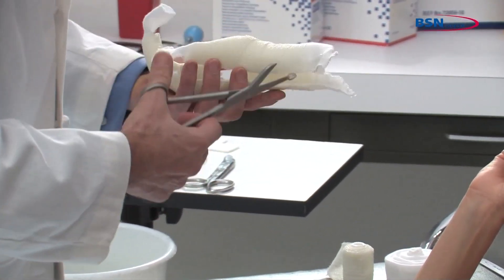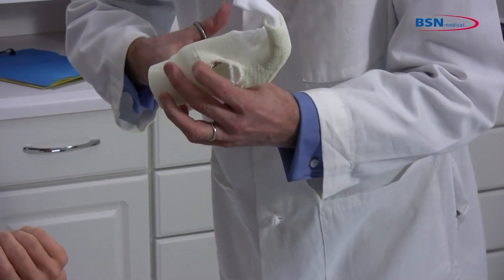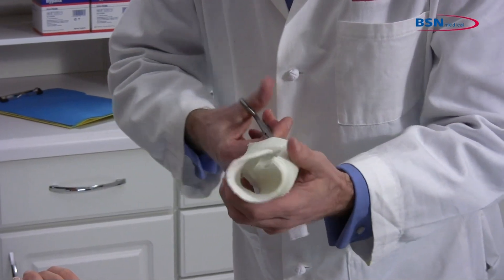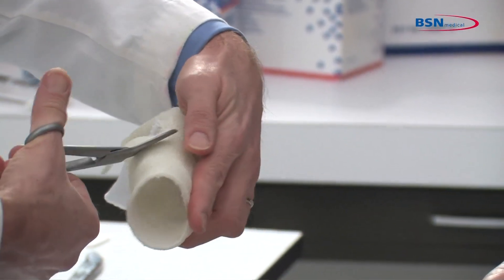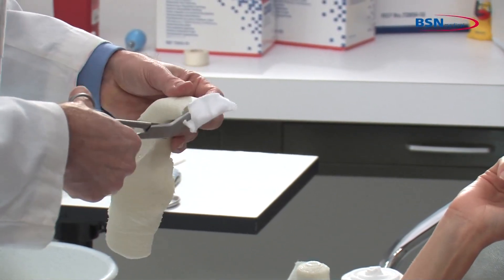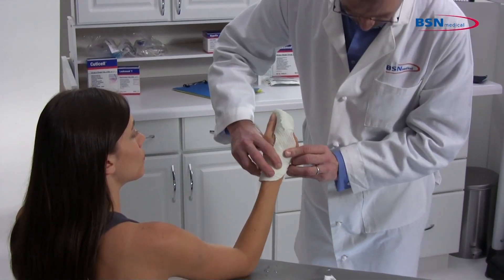Trim the borders of the cast for a good fit and round any sharp corners. Once completed, place the cast back on the patient and trim any areas that may cause irritation or limit the range of motion.